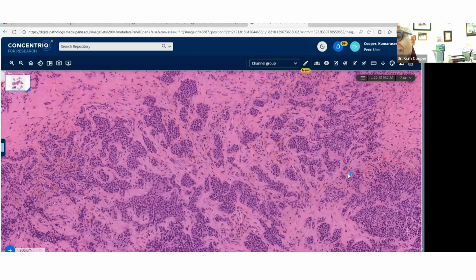Ependymoma, we did the EMA there. We didn't include a GFAP, but my very astute neuropathology colleagues did. And so it was negative for ependymoma. They can occur outside of the neural axis. They can occur in front of the sacrum, behind the sacrum, the buttock. So yeah, being aware of that as well.